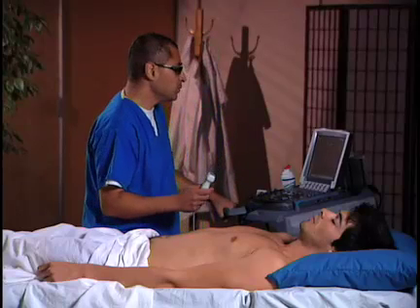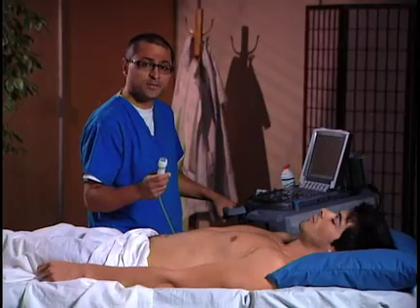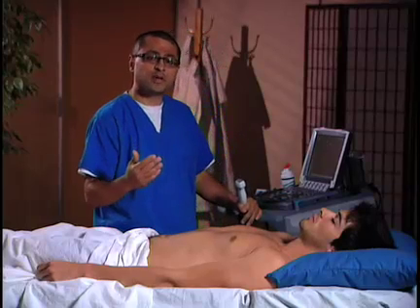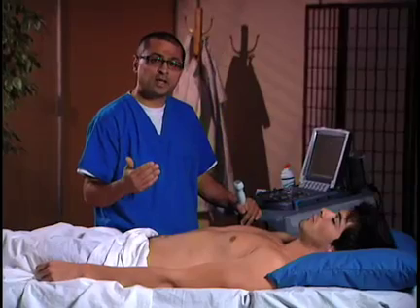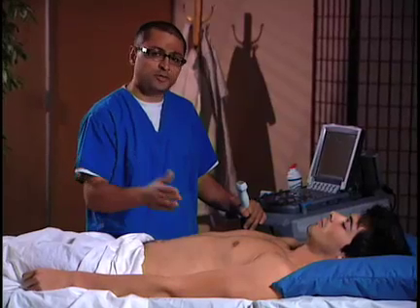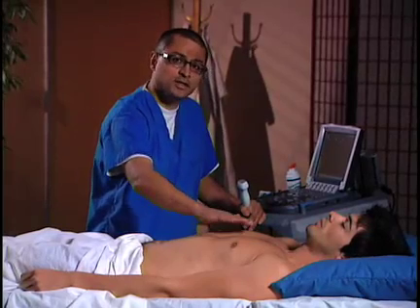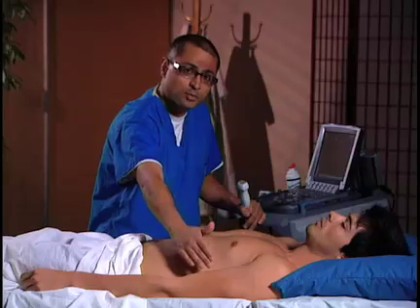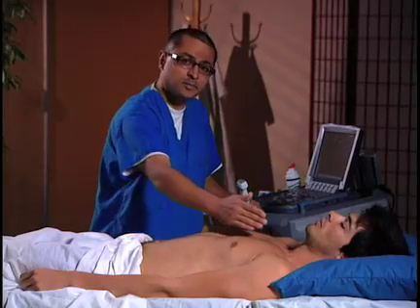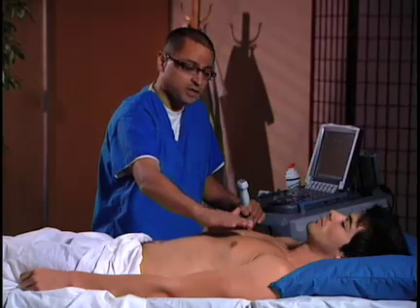The exam type has already been set up in an abdominal preset and so we're ready to start scanning. The area that we're going to scan is where we would expect air to collect in the presence of a pneumothorax — that would be the most anterior aspect of the lung. We would expect air to collect more likely on the anterior surface than posteriorly, so I'm going to scan about mid-clavicular line at the most anterior area of the patient's body.